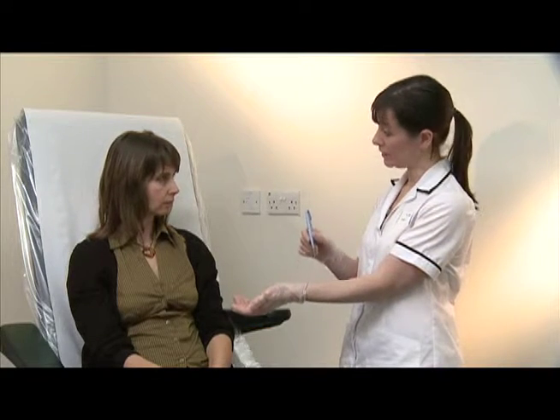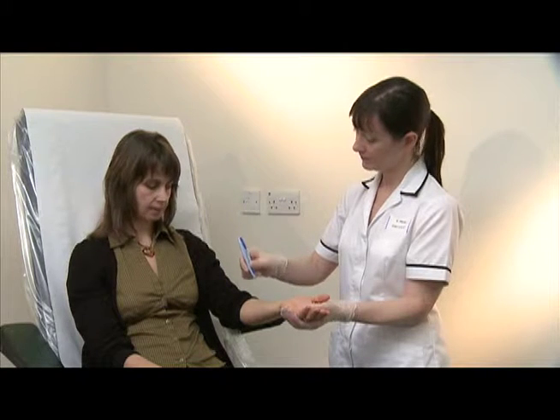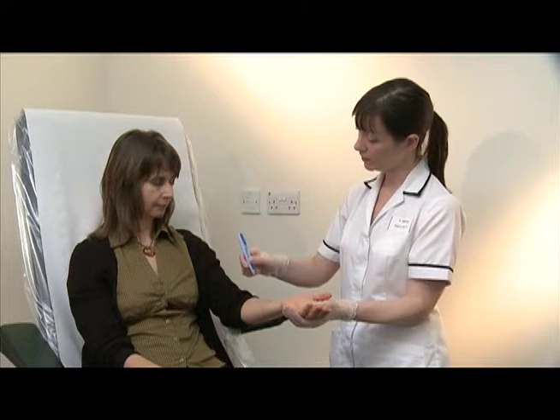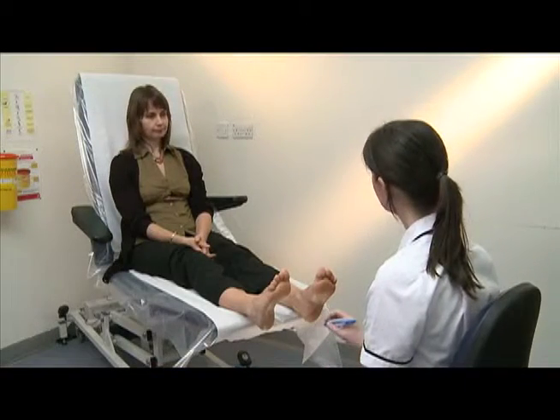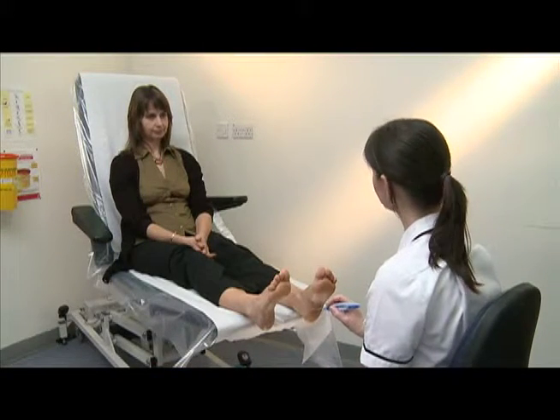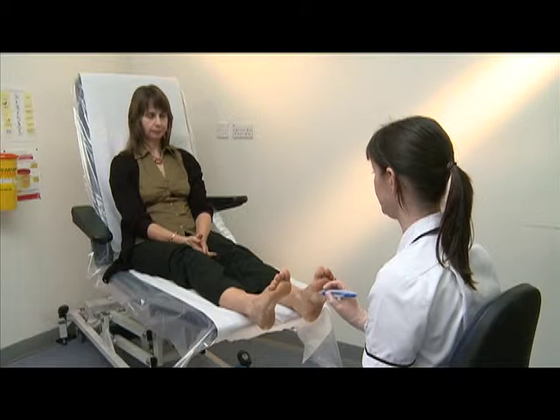I'm about to test the sensation in your feet using this monofilament, but first of all I'll test it on your arm so that you can see that it doesn't feel sharp. Okay? You feel that? Yes. And if you close your eyes, can you still feel it? Yes. Okay. I am now going to test the sensation in your feet, so if you'd like to close your eyes and just say yes each time you feel anything on your feet. Okay.